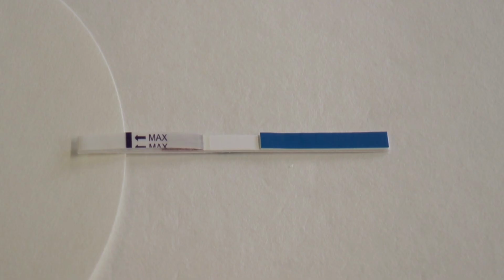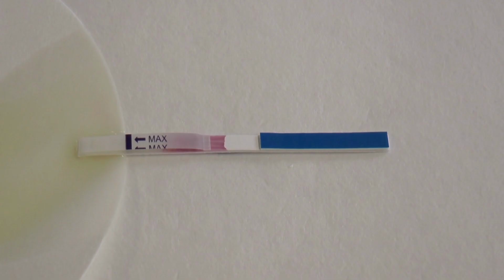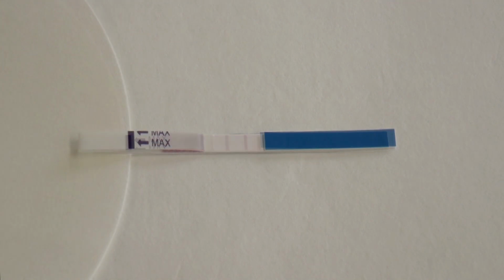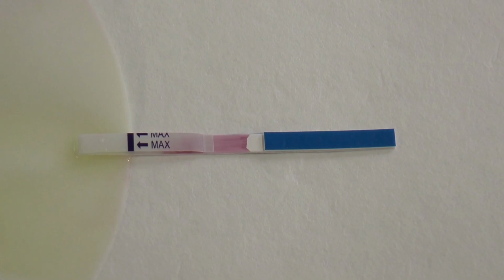In this video we're going to show you how a lateral flow test works using the example of a pregnancy test. This first video we've just got some snapshots and it just shows a positive test with a positive sample with the hormone that we're trying to detect in the sample, and then this second video shows a negative result where we have a sample with no hormone present, none of the HCG is present that we're trying to detect.